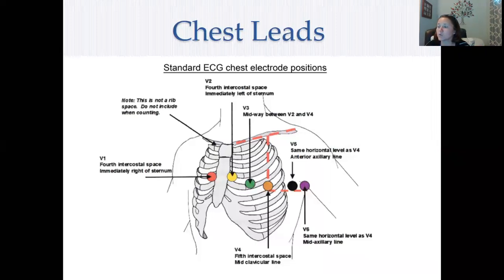All right, with a 12-lead EKG, we've got a few more to place. Typically, those 5 leads are what you're going to see in a hospital setting at the bedside. That's what you're going to have your telemetry patients on. Most CCU patients are going to be on a 5-lead monitor. Sometimes you may see your CCU patients on a 12-lead all the time. So let's look at that 12-lead.